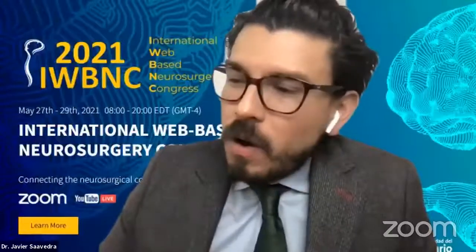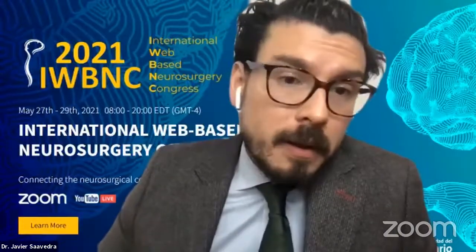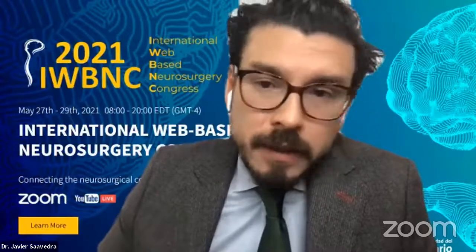Okay, thank you. Here we've got a question in relation to the trigeminal nerve. In your experience, as you can access the trigeminal nerve, is this technique a viable approach for atypical trigeminal neuralgia? I haven't read any paper on that either. But if you want to perform an ablative procedure, I'm pretty sure that it is. But I think there are percutaneous procedures that are more easily done. And if you want to do microvascular decompression, I don't think that's the right way to do it.